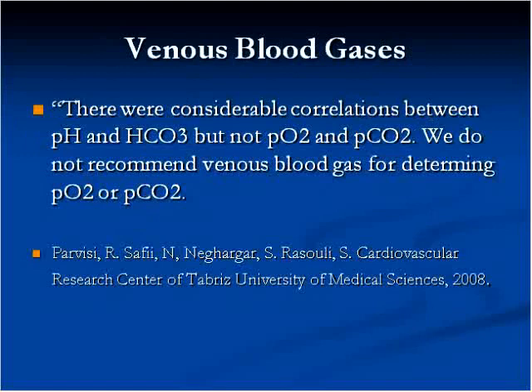In another article, just to show this, there was considerable correlation between pH and bicarb, and of course bicarb is calculated from pH and PCO2, but not PO2 and PCO2. And this particular hospital did not recommend using venous blood for PCO2 or PO2 determination.